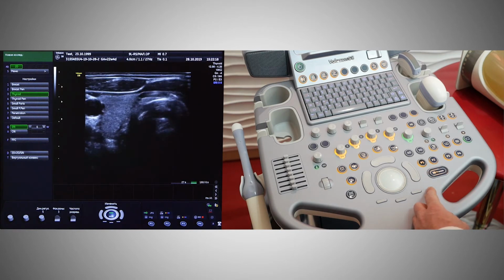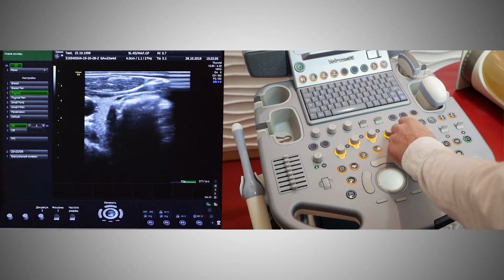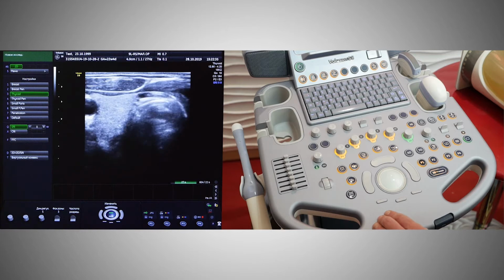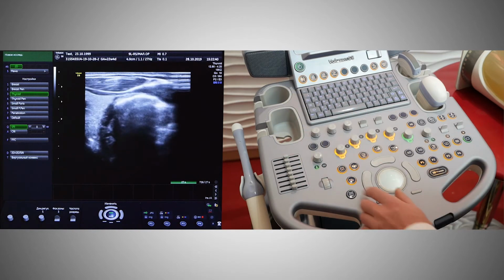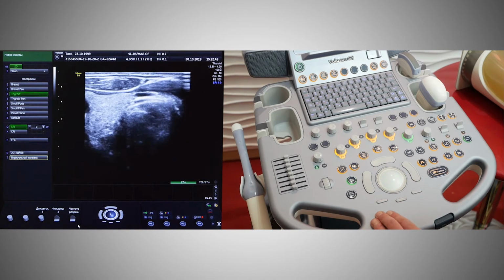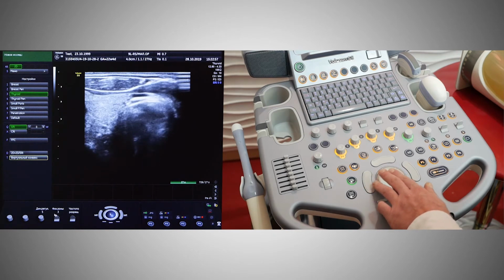How to adjust the image? Each function that is activated by these knobs is also increased by it. That is, activation, pressing a knob, amplification, turning it. What does this device allow us to do? First, the frequency change. The knobs which are used are depicted on the screen. At the bottom of the screen, it is written what exactly each knob is responsible for. These are functional keys that change depending on the mode of device work. In this case, frequency, focus, number of focuses and dynamic range.